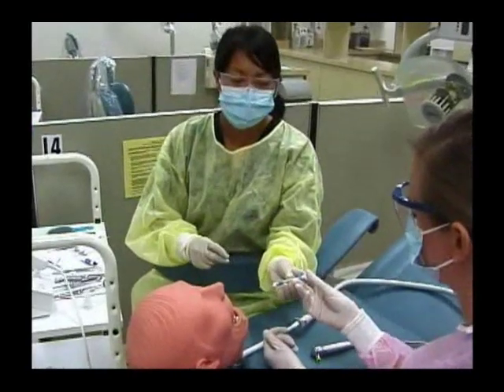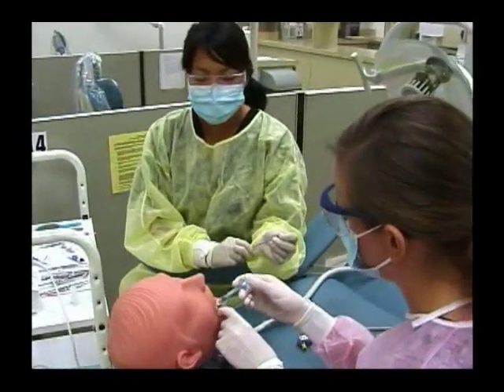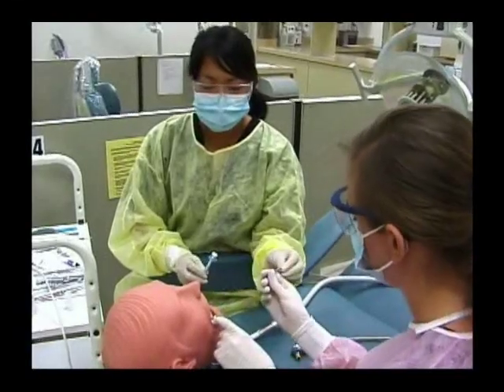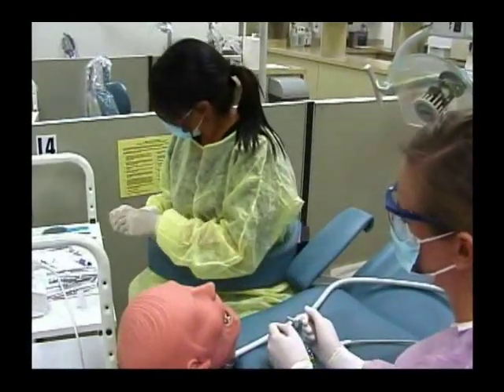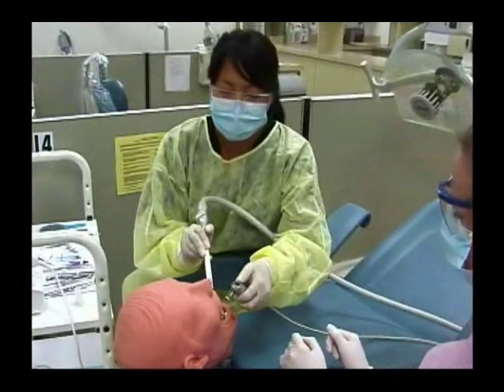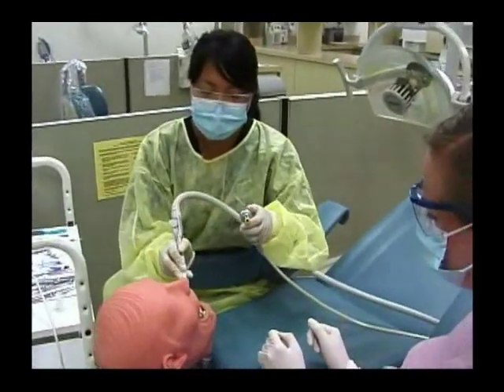Then we would etch the tooth. After we etch the tooth, we need to rinse out the mouth and suction.